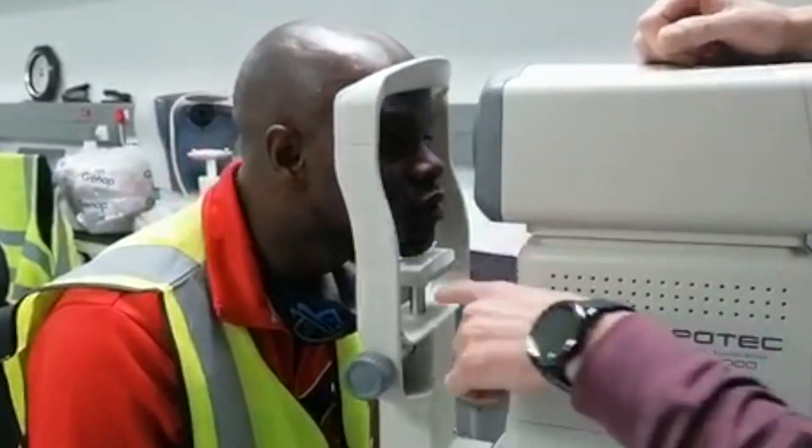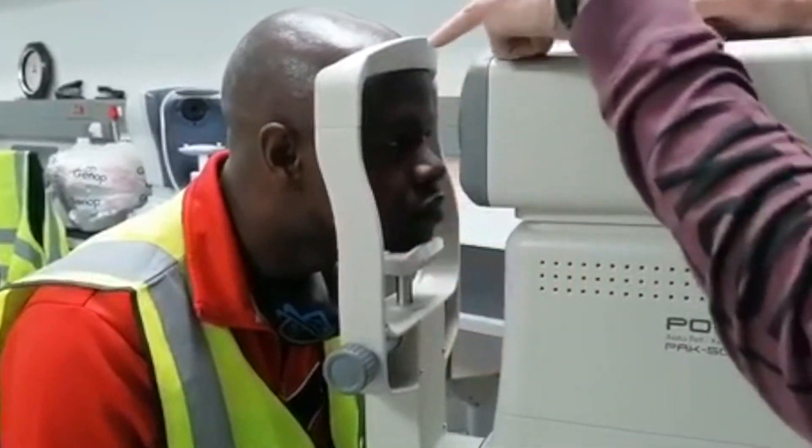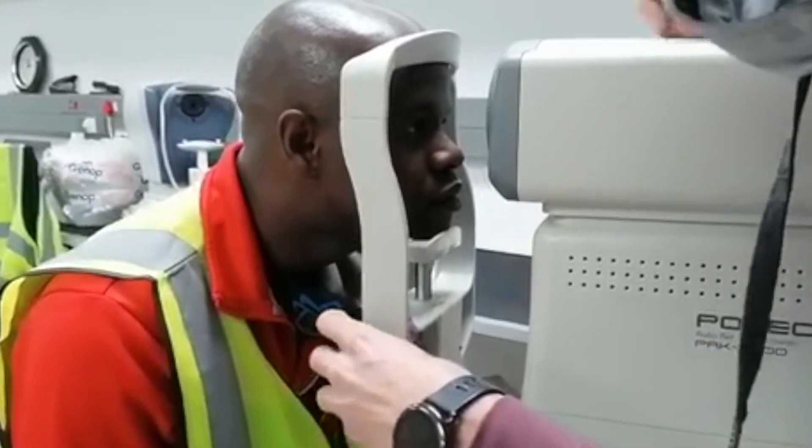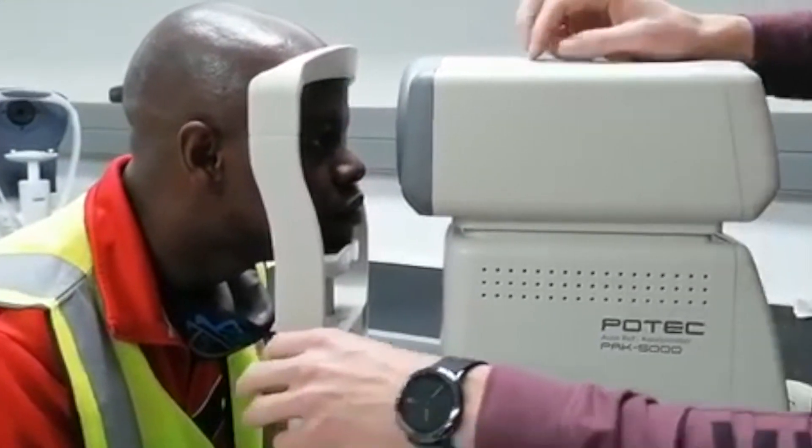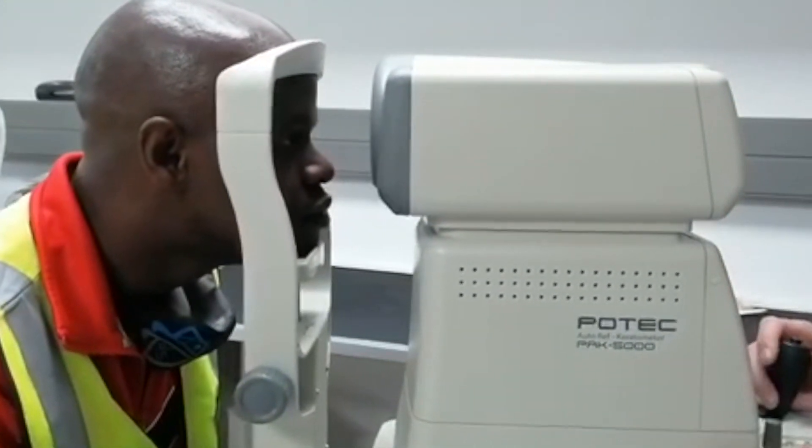Just sit in there, chin rest all the way in, forehead all the way in. You see line up the eye there, just up and down here. It just makes it easier for the patient here to do it.